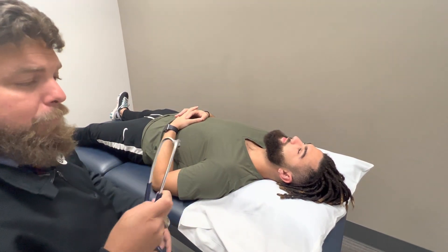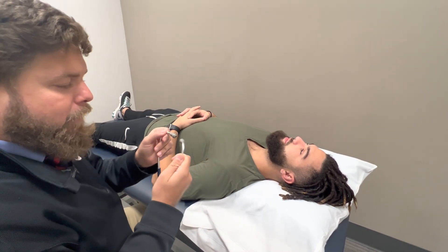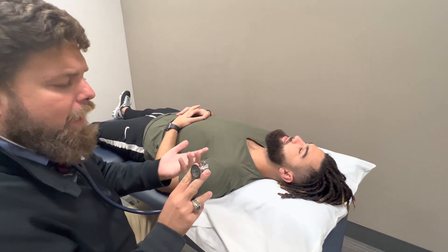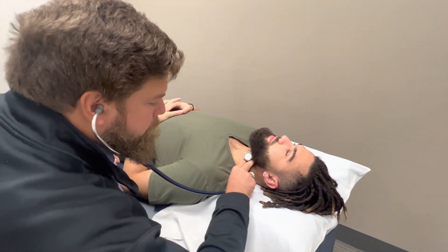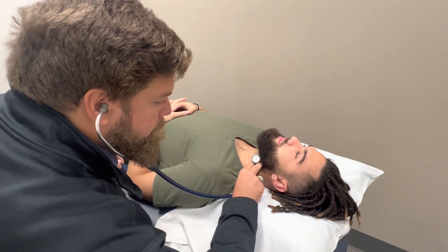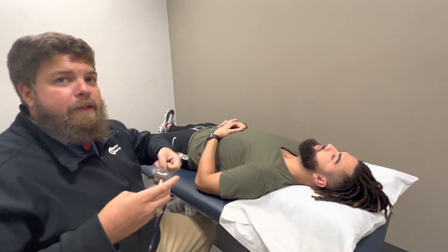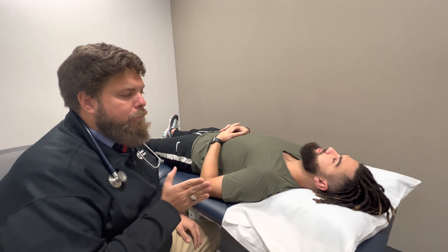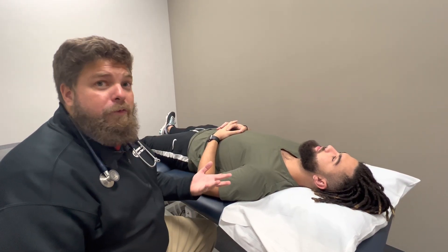We're going to place our scope in, and we always palpate first so we know where we're placing it. Always ear buds facing towards your nose. We use the diaphragm for this — I've seen some books using the bell, but we'll use the diaphragm. And his sounds nice and clear. You may also get some higher-pitched tracheal noises, potentially, if you're a little bit more medial, closer towards the airway. But that's carotid auscultation in a nutshell — pretty basic skill.